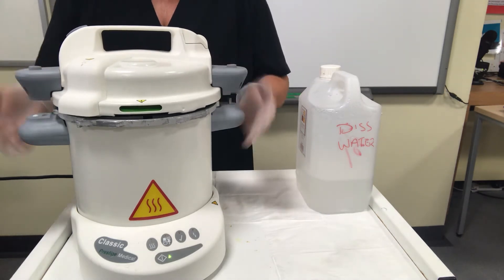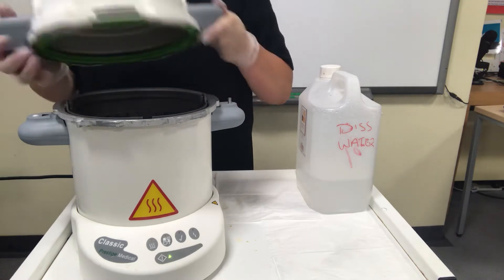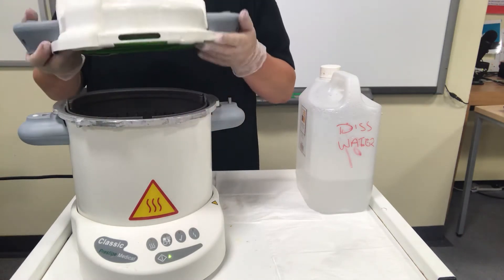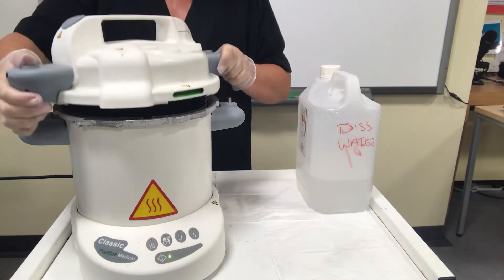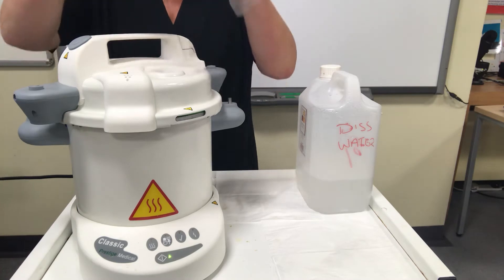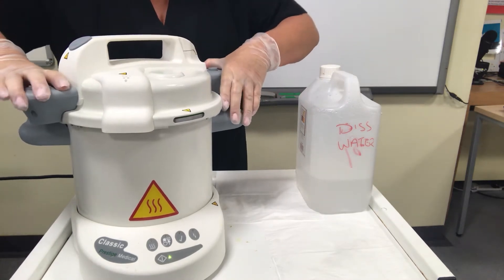You'll see there are two gray handles on the lid and two gray handles on the base — they must line up. It's a bit like a pressure cooker in that it needs to have a seal. Put the handles at an angle, allow the lid to slot into the spaces provided, and then simply twist.